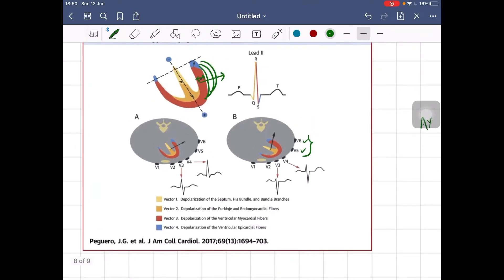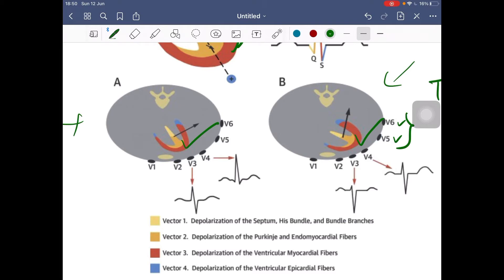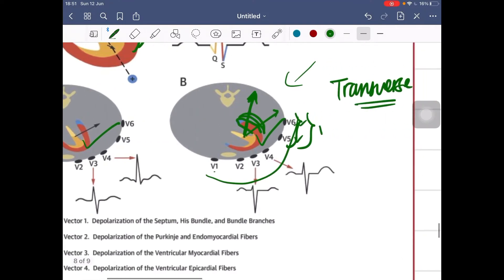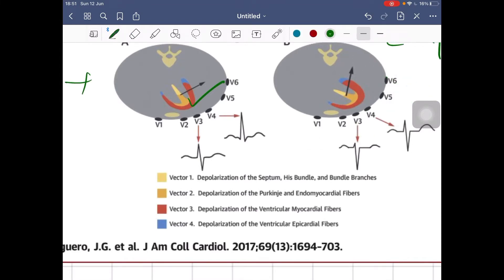Looking at a cross-section of the body in the transverse plane: in a normal heart versus an LVH heart, as left ventricular bulk increases, the overall amplitude of electrical current shifts posteriorly and toward the left. The chest leads V1 through V6 detect these changes. As electrical current shifts leftward and backward, the height of R waves in left-sided chest leads V5 and V6 becomes more prominent, while S wave depth increases in right-sided V1 and V2. We use V1 and V5 or V6 for LVH diagnosis.